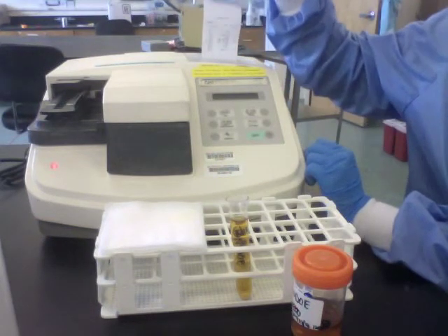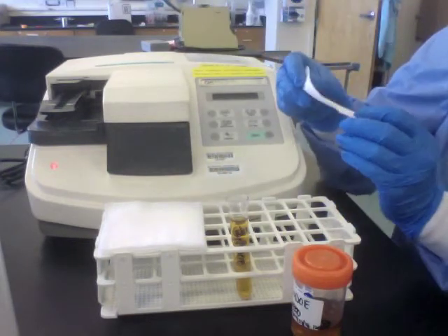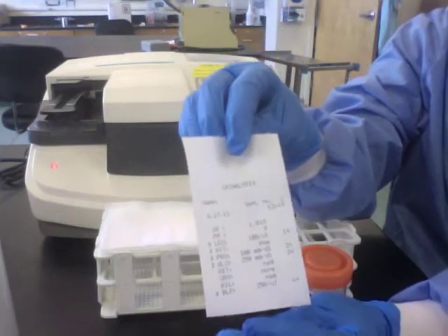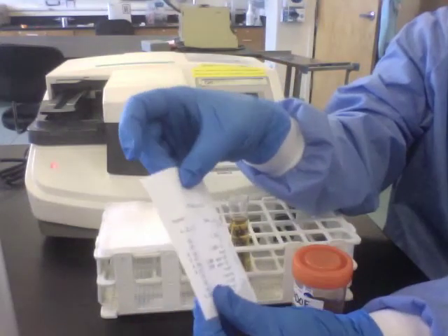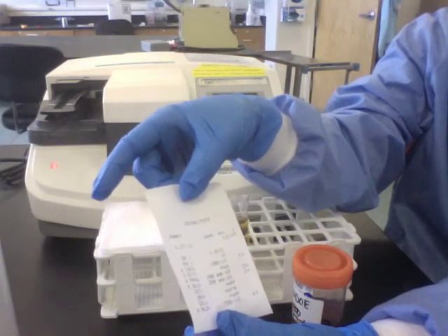Once your results are finished, they will print out, and your abnormal results will be flagged by an asterisk. Be sure to write your patient identification immediately on this printout.